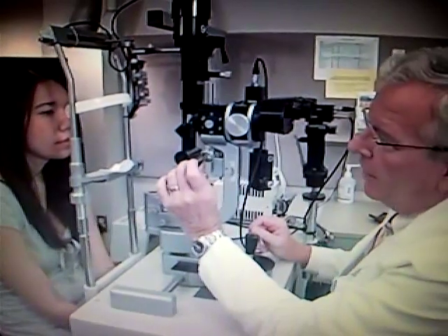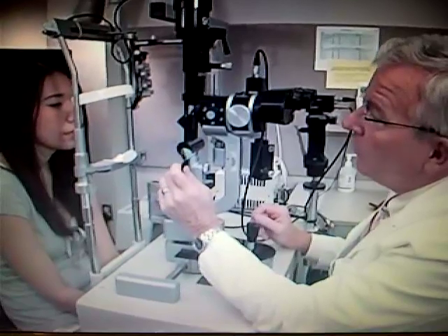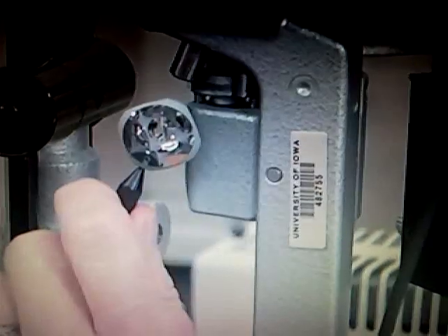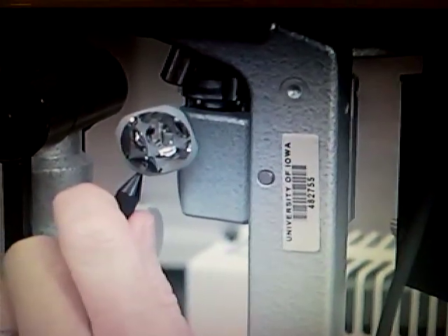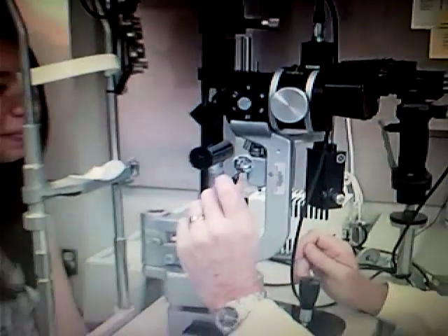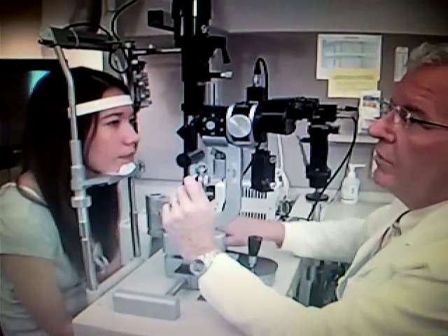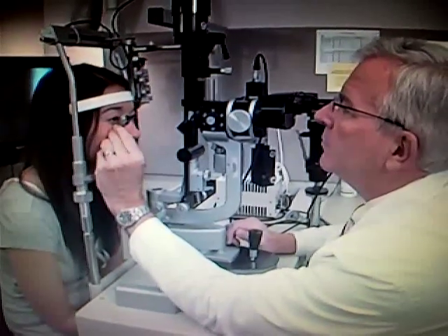It is important that the patient be relaxed. The examiner should be honest, but not too descriptive of the procedure. I usually say that this lens will come close to your eye, but will not hurt your eye, and you will feel it touch your eyelashes. This is honest and prepares them for the sensation of the lens touching their eyelids, but it's not fully descriptive. Saying something like 'this sharp piece of glass will be lying against your eye' is only going to make the patient anxious and is not beneficial.